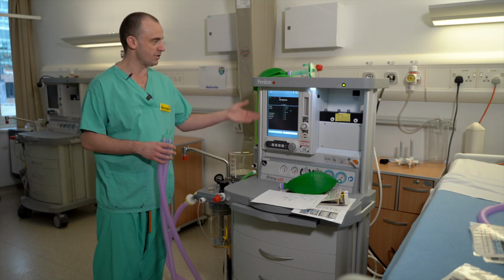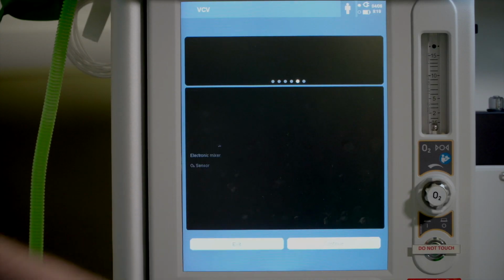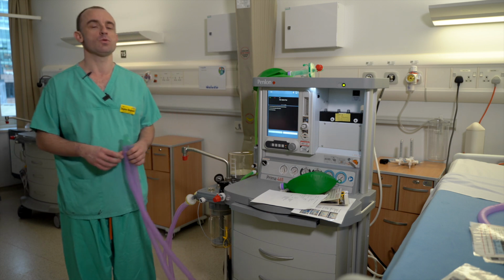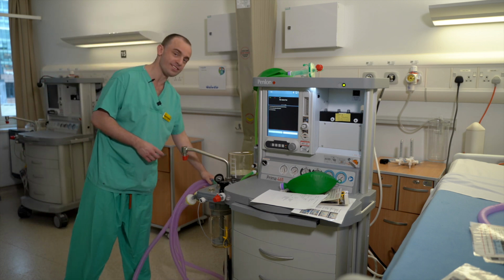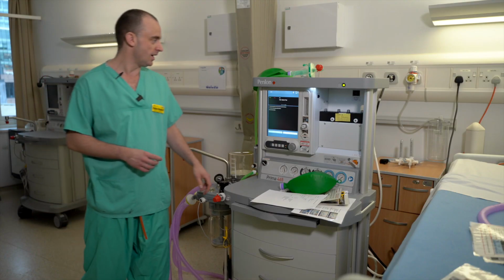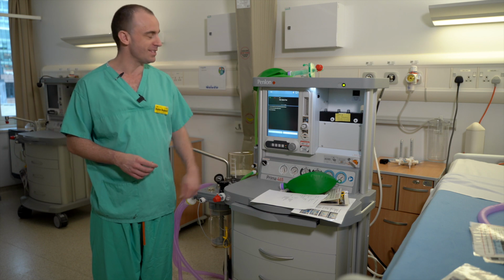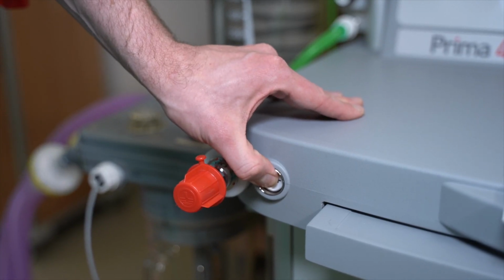Having completed the initial part of the system test and seen that we've got a pass at every point, we're going to continue. The next thing that it's going to want to do is it's going to ask us to occlude the Y piece. So on the side of the machine here is a small area that you can twist and put on. You'll note here that it asks you to press the oxygen flush button. So this is here, and this is used only in the test.